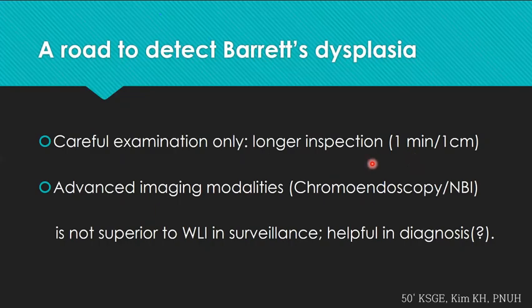PIT, requires 7 minutes. Like when we do colonoscopy, in order to find colon adenoma well, we spend at least 6 to 7 minutes when we withdraw. It's something similar. For Barrett's esophagus, we need 7 minutes, or at least 1 or 2 minutes, to inspect that area. And then we have to learn those kinds of things as well.